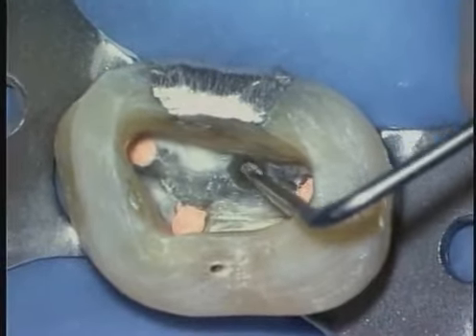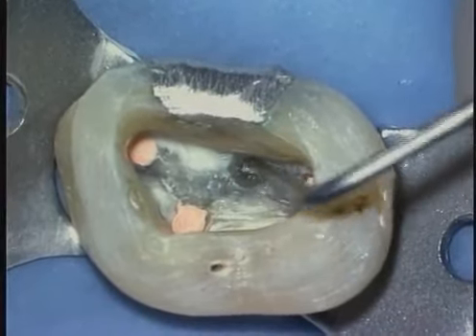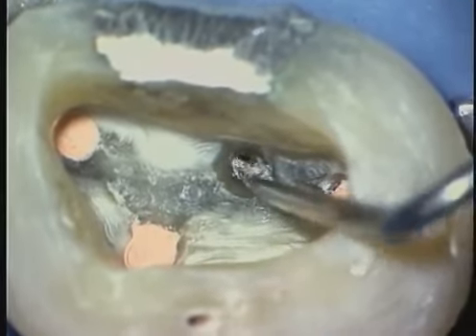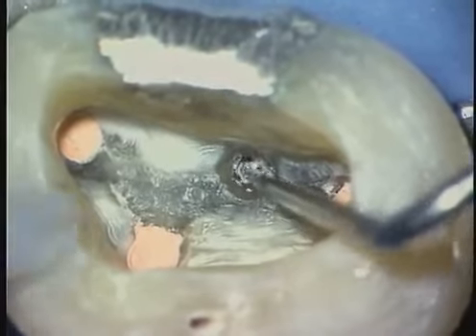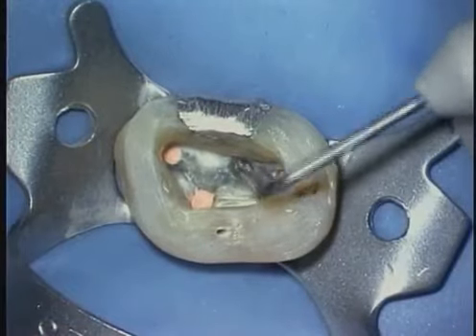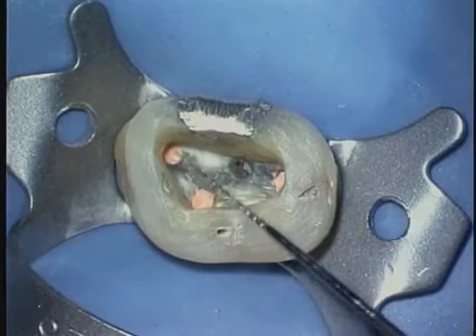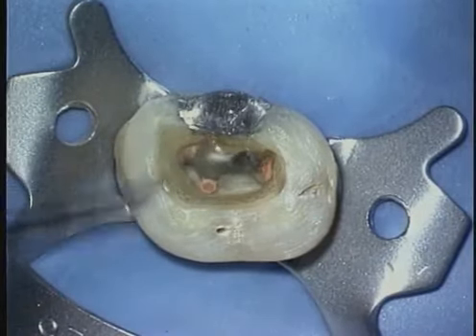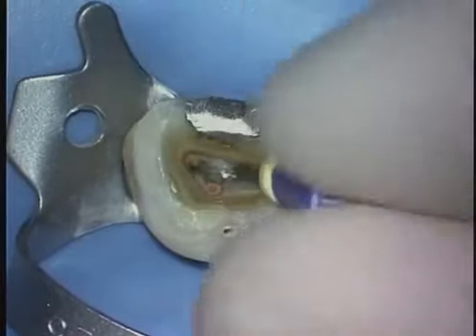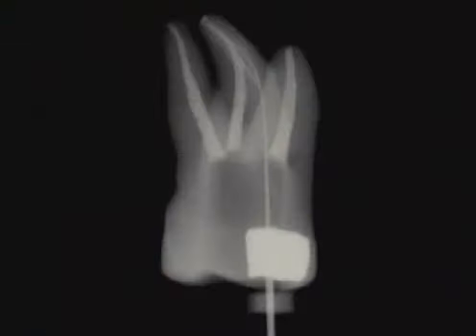It has 7 millimeters of cutting blades, and you can see that virtually all the blades are below the pulpal floor. This means we're clearly in the coronal 1/3 of the root. Typically, I'd like to have irrigant in here at this time, but for teaching purposes, I want you to see how effective the micro openers are on the pull stroke. They can be used very vigorously because of their larger cross-sectional diameters. Irrigate these teeth and flood them with solution. Sodium hypochlorite is a good lubricant, helps instruments slip and slide to length and negotiate canals.